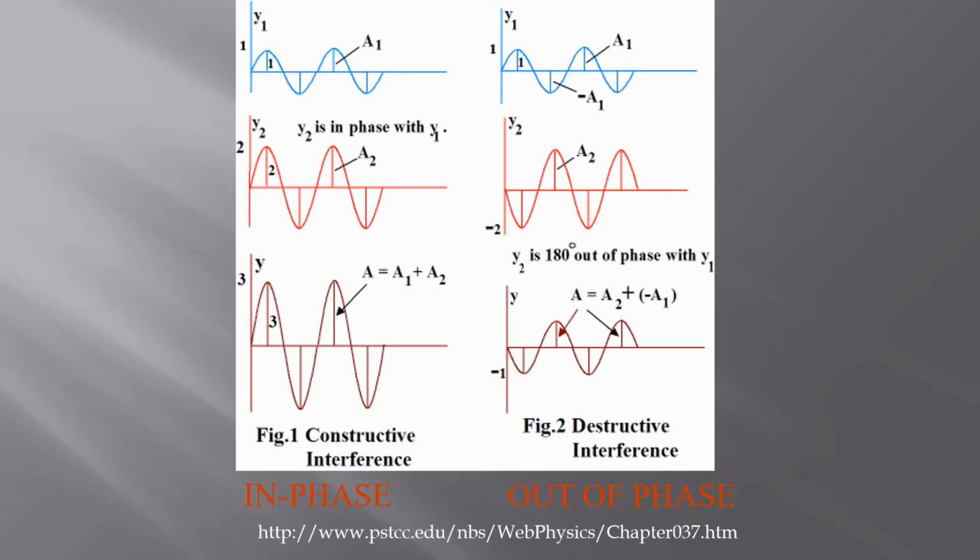Here's a diagram emphasizing the benefits of keeping molecules in phase when you're making an MRI image versus out of phase. If you want to optimize your signal, it's good to have your molecules stay in phase, because then when you add their signals together, it's a constructive interference. It basically builds your signal. You have better signal to noise. If molecules are moving, it tends to cause dephasing, loss of signal, and then when you collect your image, you have a smaller waveform, you have less signal. Now with diffusion imaging, you're smartly using this to create areas of lower signal that you can then utilize to look at the white matter directionality and the underlying white matter integrity.